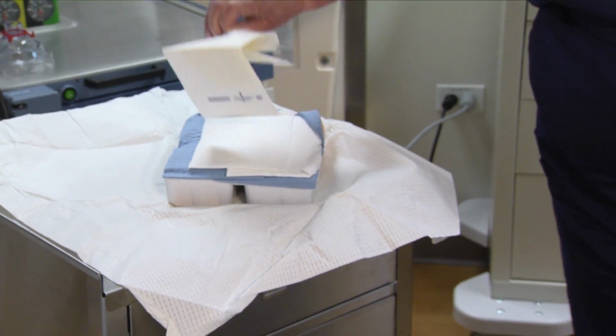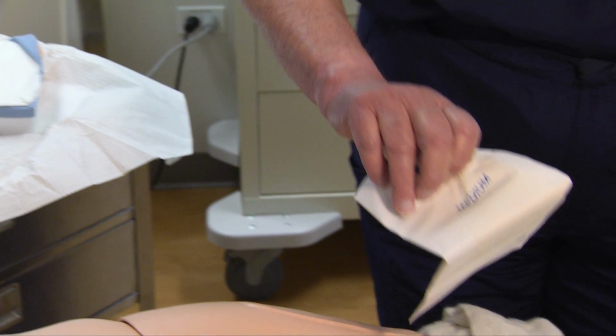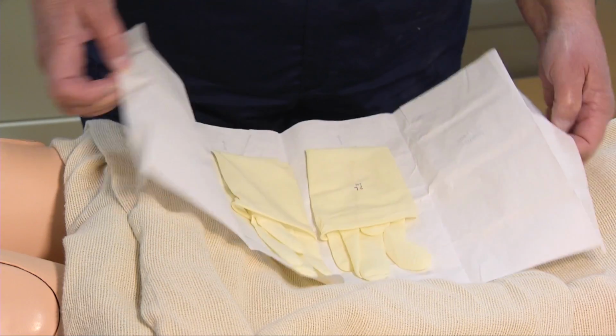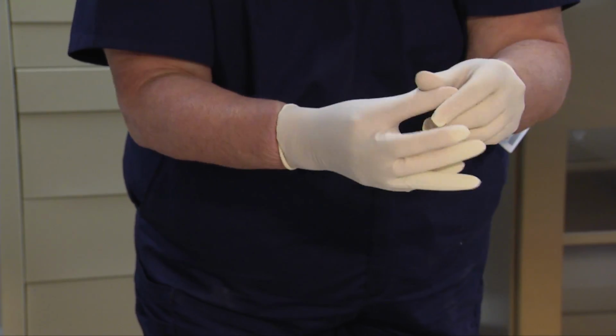the glove wrapper and lifting the gloves up and away from the prep set, allowing at least 12 inches of space in all directions. Place the glove wrapper on a flat surface, open the package, and don the sterile gloves using the open gloving technique that you learned previously.